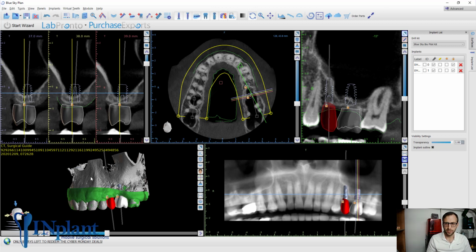This was a difficult sinus lift, as we talked about in the last video, but again, this doctor lives out in rural Minnesota, so there are no oral surgeons in the area. If he wasn't going to do this procedure for them, it just wasn't going to be done. So again, it's a doable procedure, but being able to work with somebody to give the confidence to actually get it done allowed us to do it.